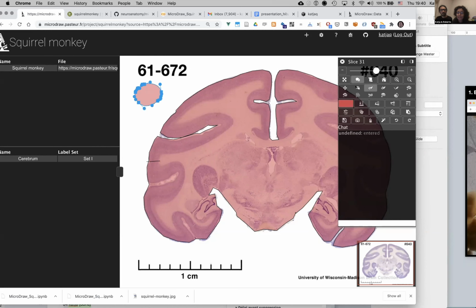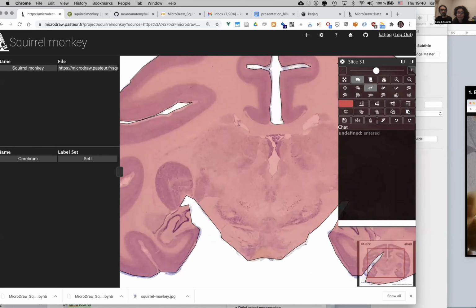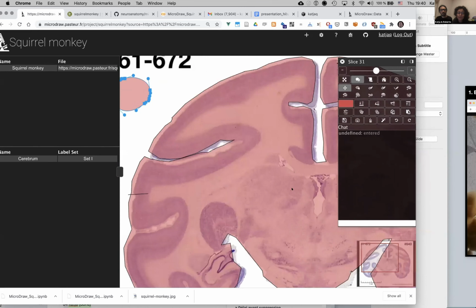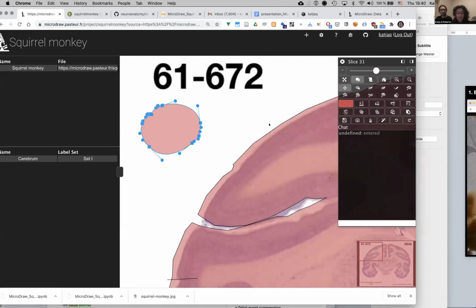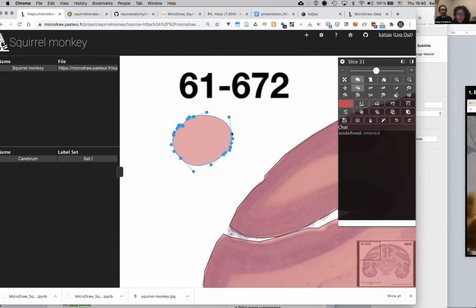And then you have different interactions with them. I can zoom in a little bit and show you. Like this, it's good. So you see the difference between the squares and the dots. When you have Bezier curves, you have the points on the path, and you have the anchor points that allow you to adjust your region's curvature.